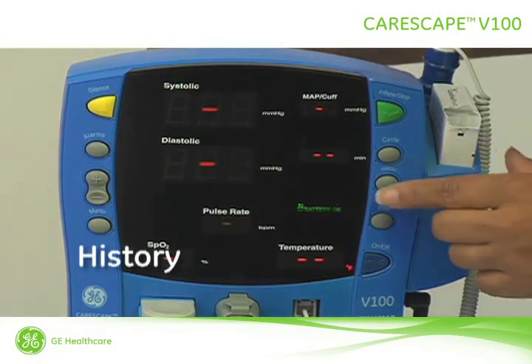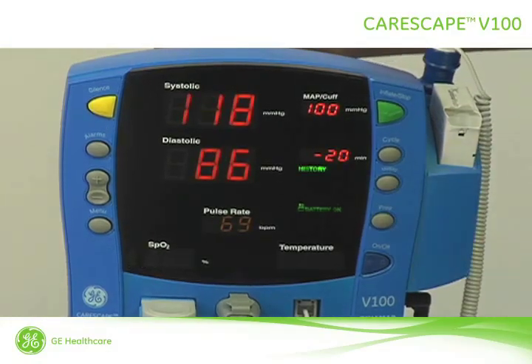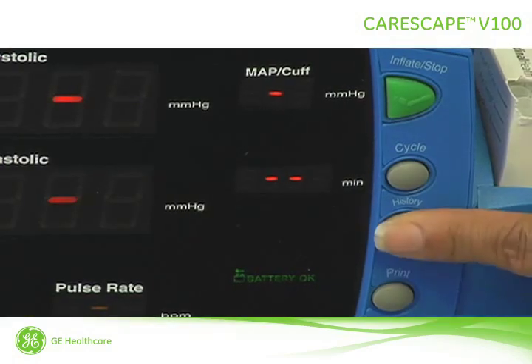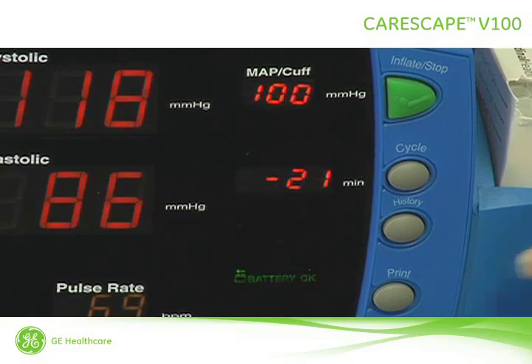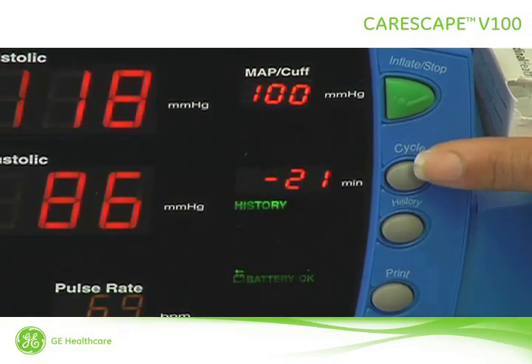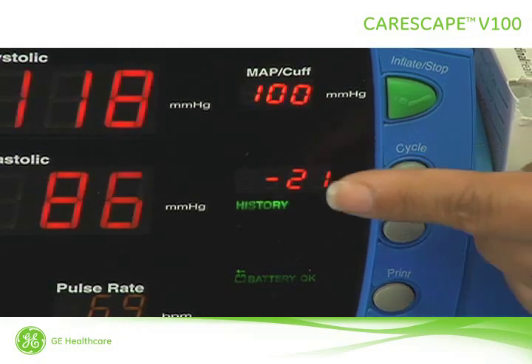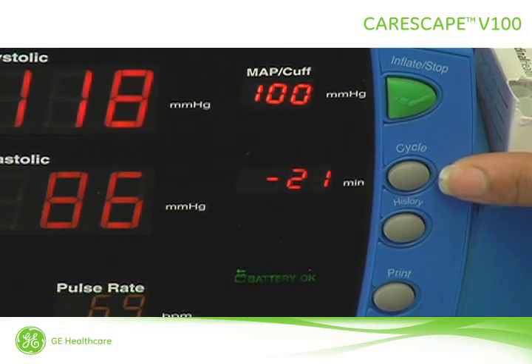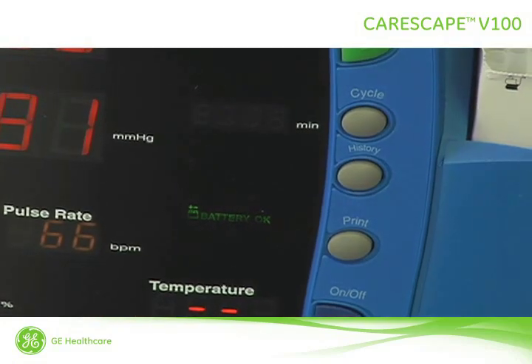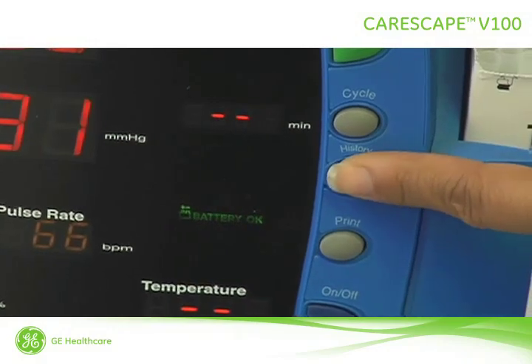Press the history button to see any of the last 40 readings. When you press the history button, history blinks underneath the minute window. Inside the minute window, you'll see a negative sign followed by a number. This number represents how many minutes ago the determination was obtained. Here we see that this determination was taken 21 minutes ago. To erase the data contained in the monitor's memory, press and hold the history button for two seconds.